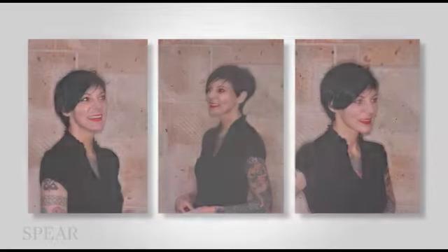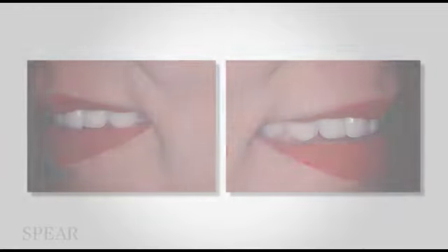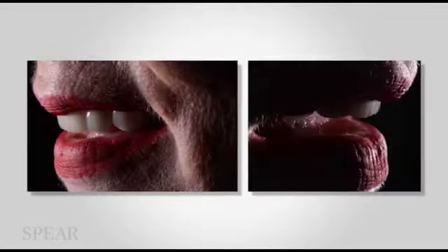Can spend some time taking some fun photos because it's a big deal. So we took some fun photos, and again, you can see the lip support that we created. The edges are in the right place in her head, and they function beautifully. Now, you can even take some different fun photos, and you can share them with the patient. You can put them in your book in your reception area, because you should be proud of this type of work. But yet, there's so many different ways to do it.